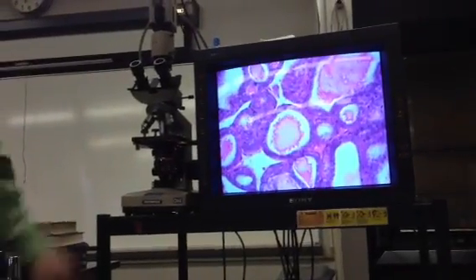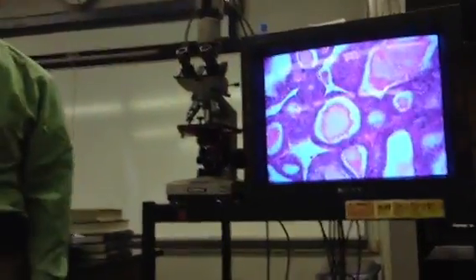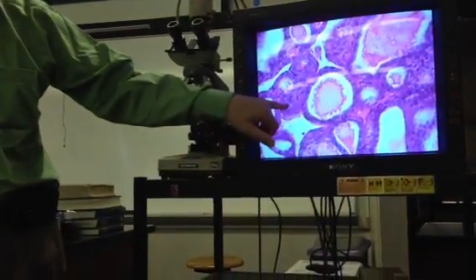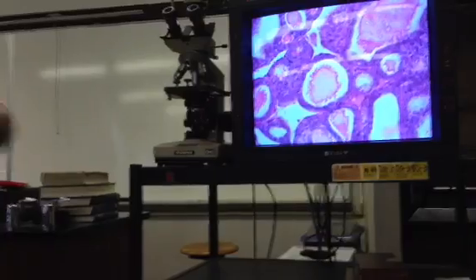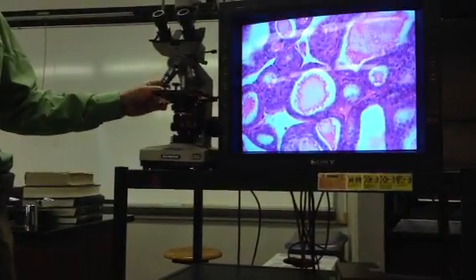You talk about the slightly chromophobic one? What do you mean slightly chromophobic? It looks different than the other ones. Yeah, you can see that the nucleus looks backlit, illuminated, because this is not the clearest example of it, but there are several here.